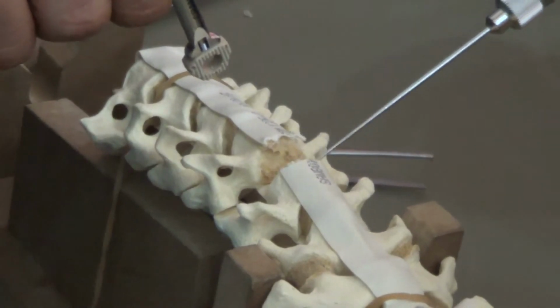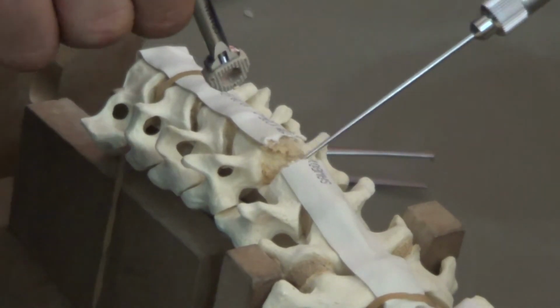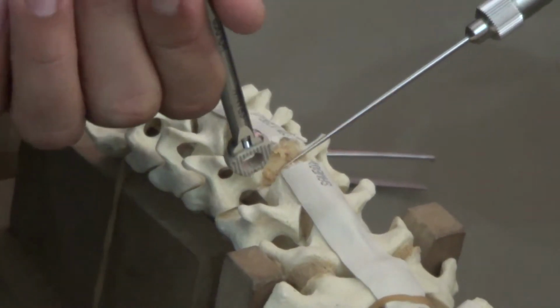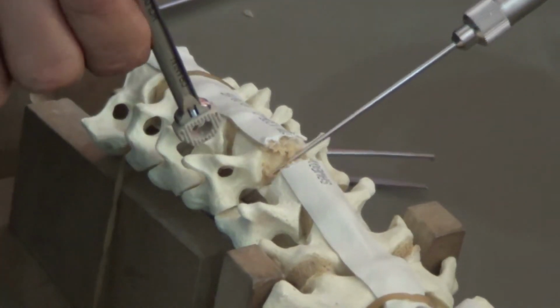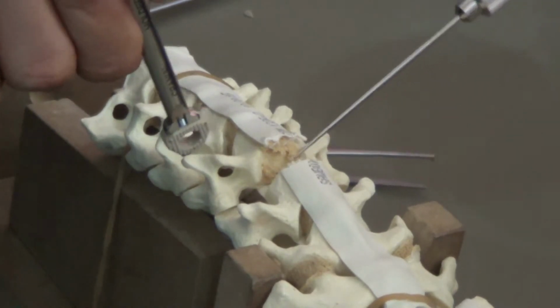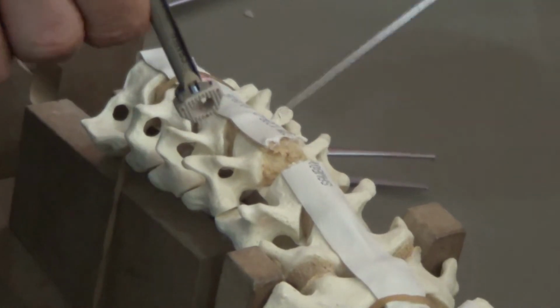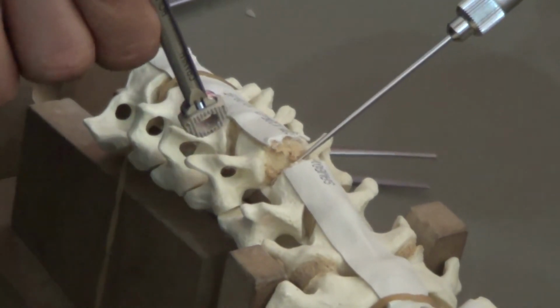So when you are totally removing the disc, you can see your articular cartilage. From anterior you can go behind and you can see the end of your articular cartilage. So you can understand, yes, this is my posterior limit. From anterior to this is my posterior limit, so I should be very, very careful.